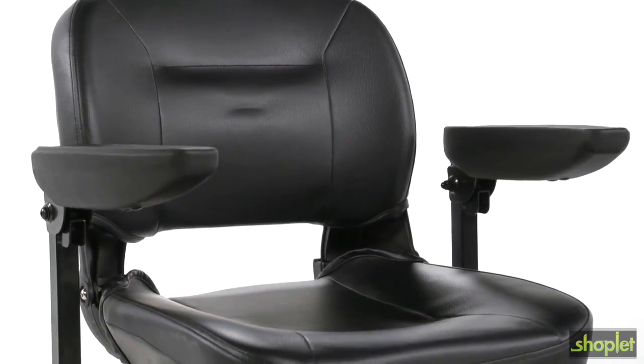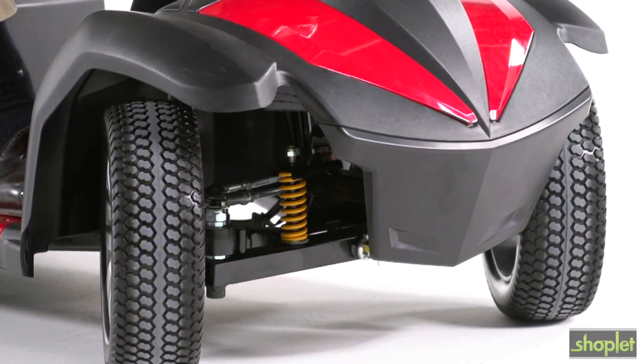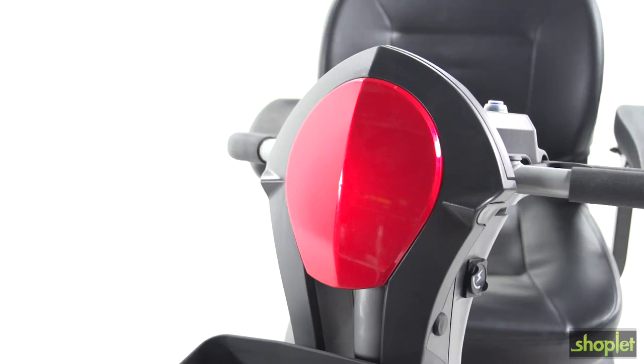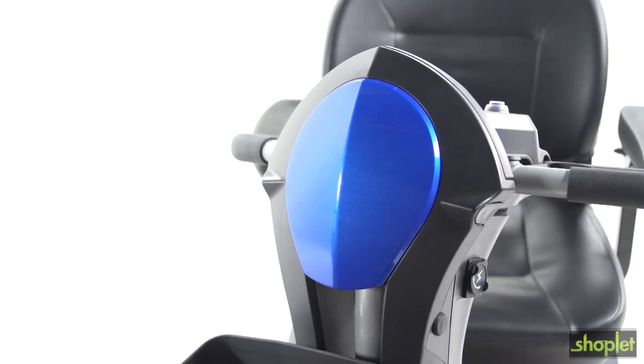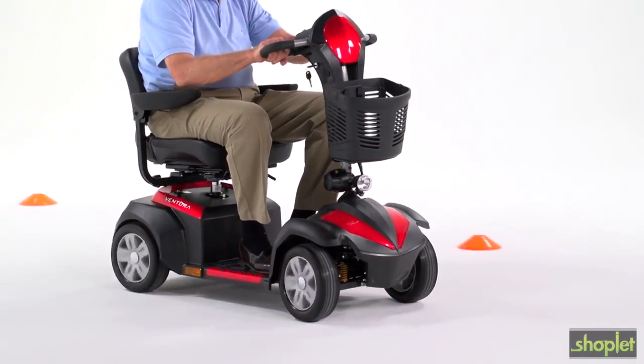Along with great performance, the Ventura offers excellent comfort with a cushioned stadium-style seat. The Ventura four-wheel ride comfort is enhanced with front and rear suspension. You can always count on Drive Medical to bring you convenient and innovative lifestyle solutions, now and for the road ahead.